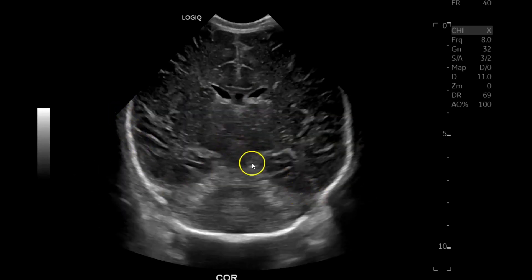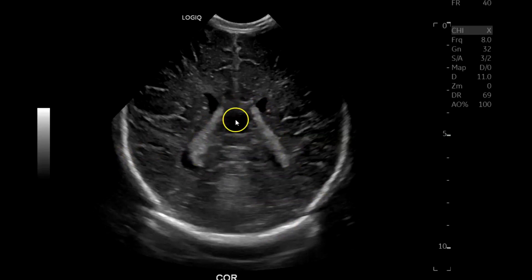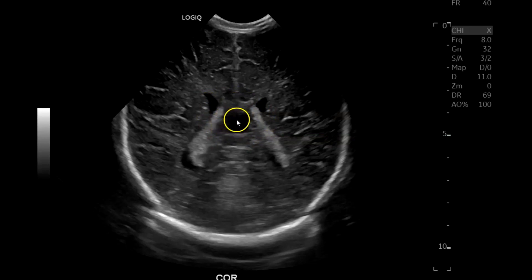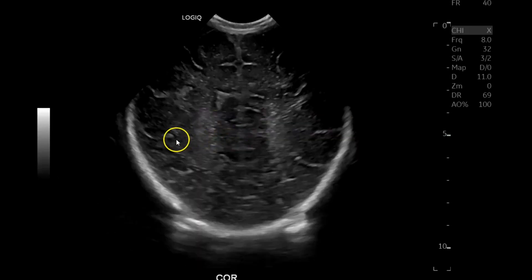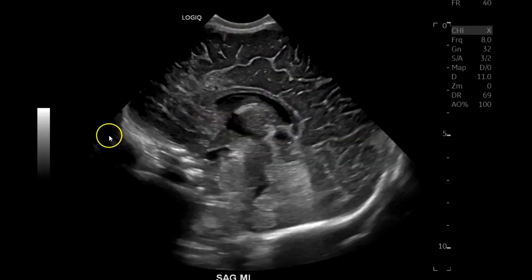Going up by the tentorium, here's the cerebellum, choroid plexus, and cavum vergae. If you see this, put some color Doppler on it because it could appear to be a vein of Galen aneurysm, but that's not the case here. Then all the way posterior, your periventricular white matter in the occipital lobes.